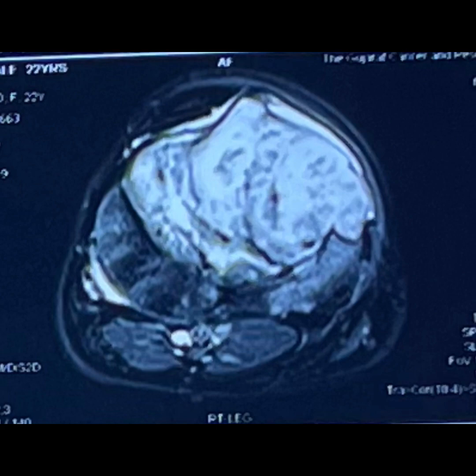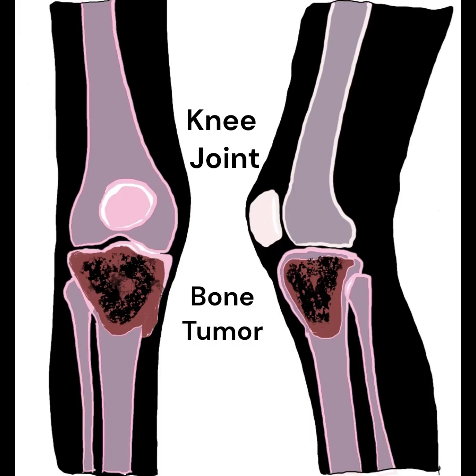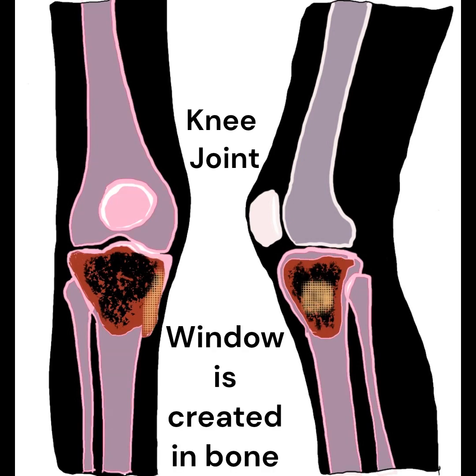A longitudinal incision is made over the affected area of the tibia. The goal of the surgery is to remove all visible tumor tissue within the bone cavity. A window is made in the affected bone, which is enlarged to look like a door of a house, allowing the surgeon to visualize the tumor properly.